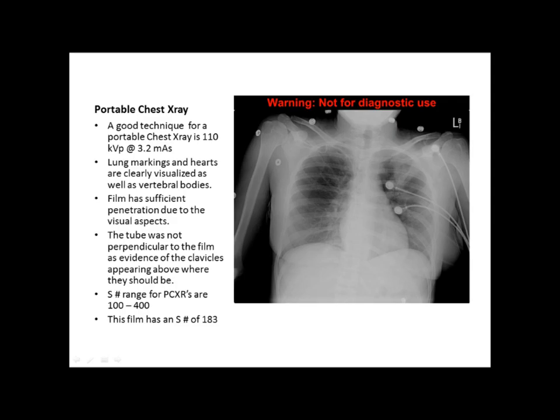The next image is a portable chest. From what we're seeing here, it looks like there was good technique. The technique for this film was 110 kVp at 3.2 mAs. The film demonstrates good lung markings, and we can tell there was sufficient penetration and exposure because we can also see the vertebral bodies posterior to the lungs. The only issues are that guide wires should have been removed, though they may not have been removable under the circumstances. The S number for this film was 183, which is perfectly in range — the standard range is from 100 to 400.